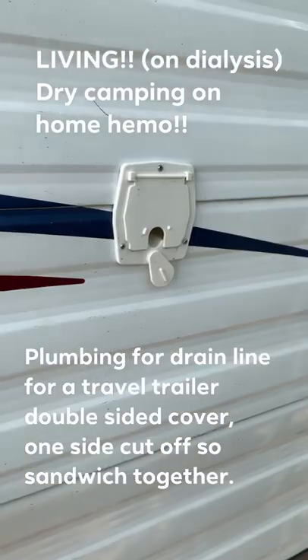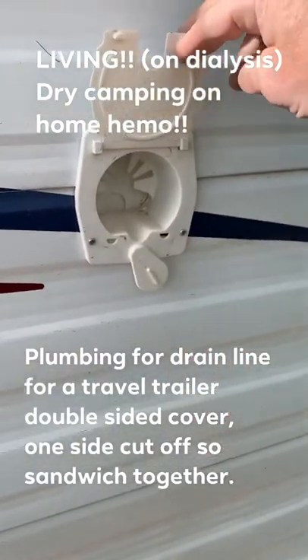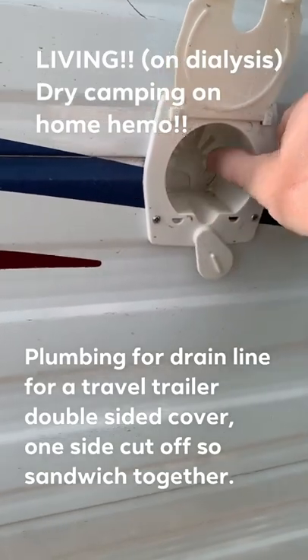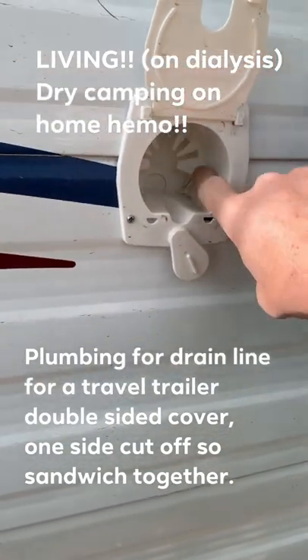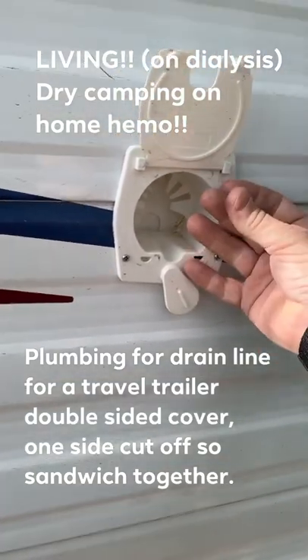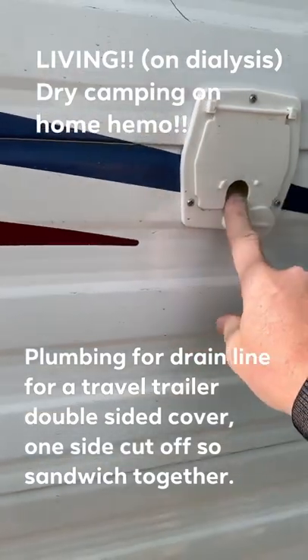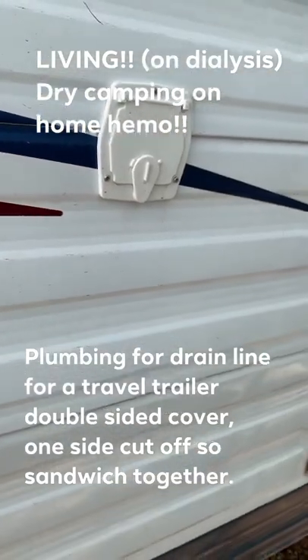As you can see, this is the outside one — it's just a hose access. This side mounts into it, and the other side is the exact same thing except I cut this part off. So it's just two of them pretty much sandwiched together. That way I can open the door and have the tube coming out, so no bugs or anything come in and everything stays locked up and secure.